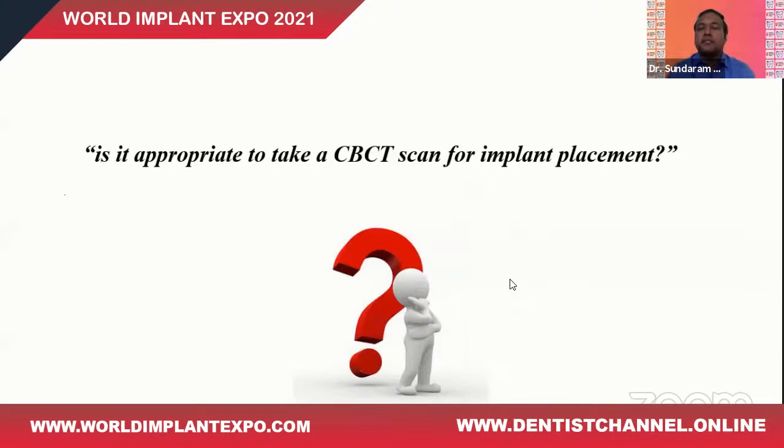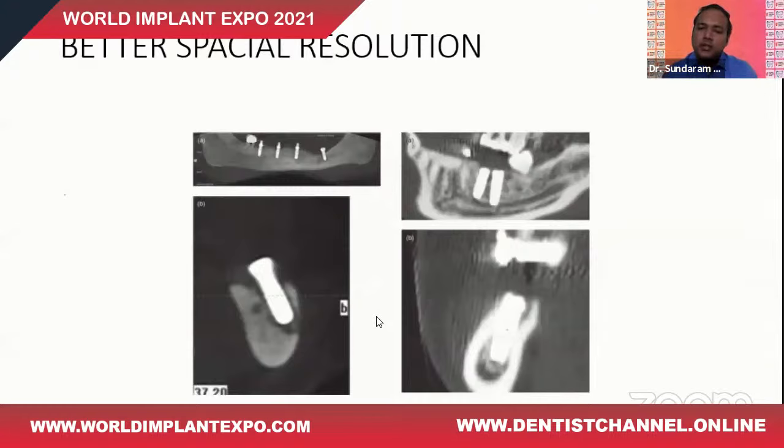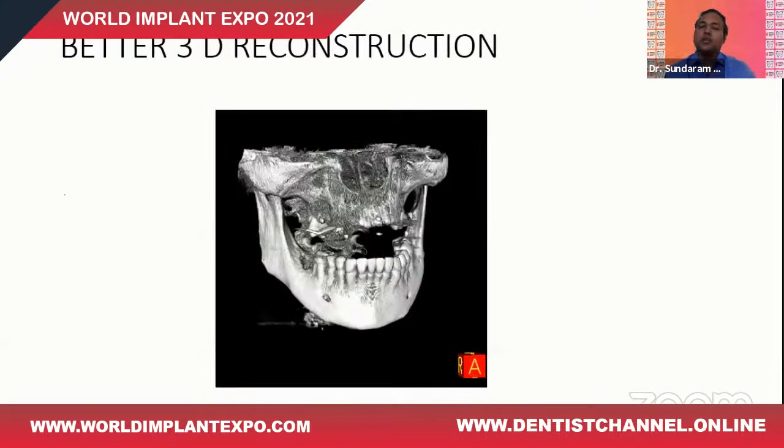Now, there are certain cases where we find the CBCT is superior, but is it really appropriate to take a CBCT scan for all implant cases? That is the next question that arises. Let me take you to the further slides. Undoubtedly, the spatial resolution of the CBCT is far better than the radiographs and also the hospital CT. And it obviously has a very good 3D reconstruction modality.